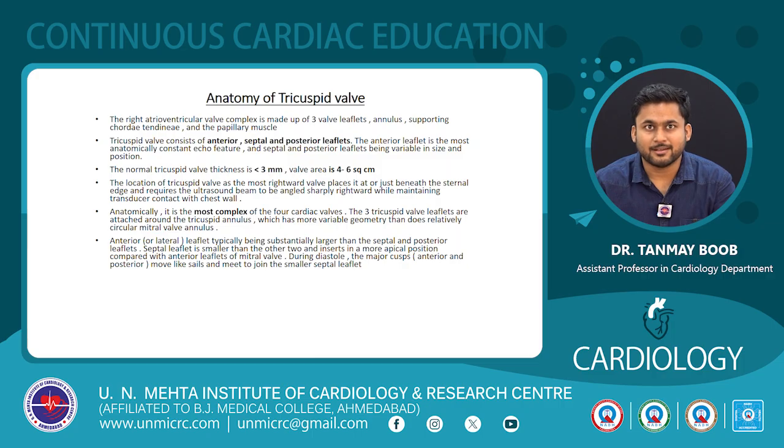So firstly, we will be learning the anatomy of the tricuspid valve, which is a right atrioventricular valve complex made up of three things: three valve leaflets, annulus, and supporting chordae tendineae, along with papillary muscles. It has three leaflets: anterior, septal, and posterior. The anterior leaflet is anatomically the most constant echo feature, with septal and posterior leaflets being variable in size and position. The normal thickness is less than 3 mm with a valve area of 4 to 6 square centimeters.